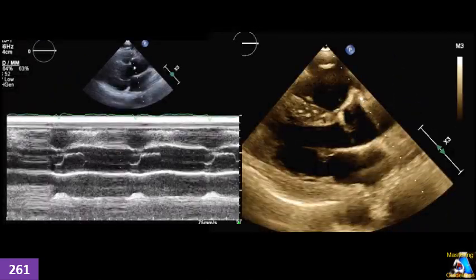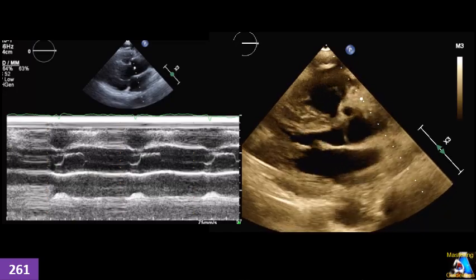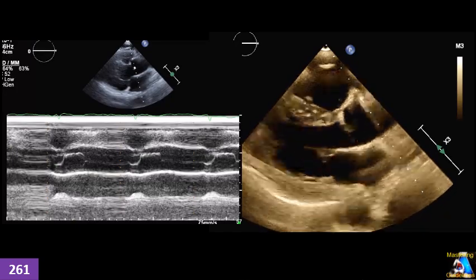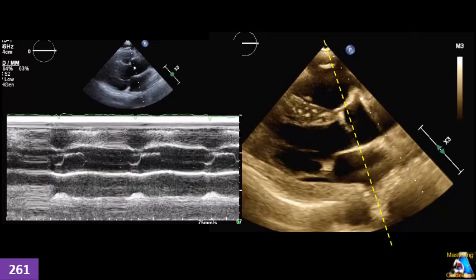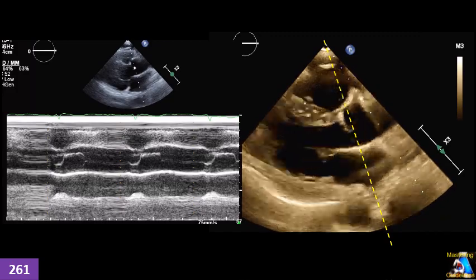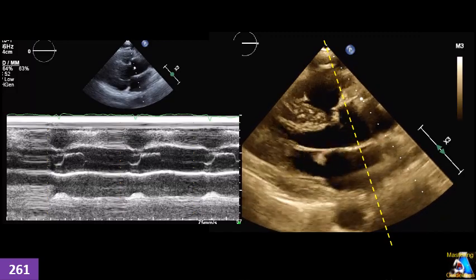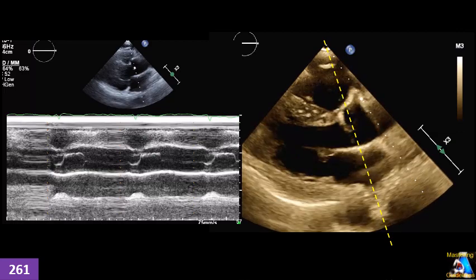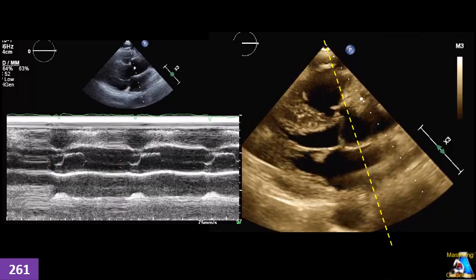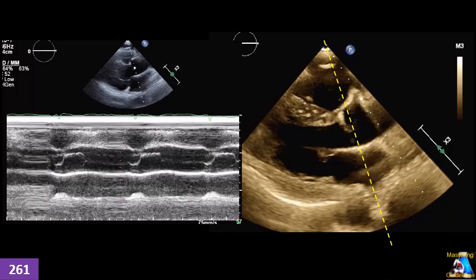Next case: we are doing a parasternal view and we do M-mode. In this case, as you can see here, our cursor passed through this line and produced this M-mode. Is it correct to measure LA on this M-mode or not, based on where our cursor passed through?